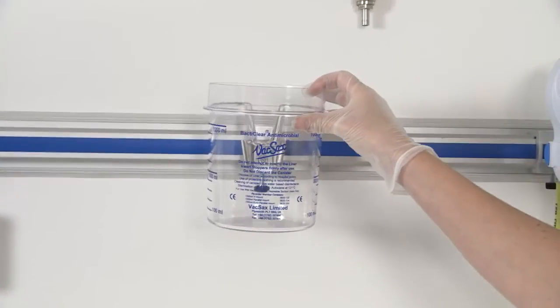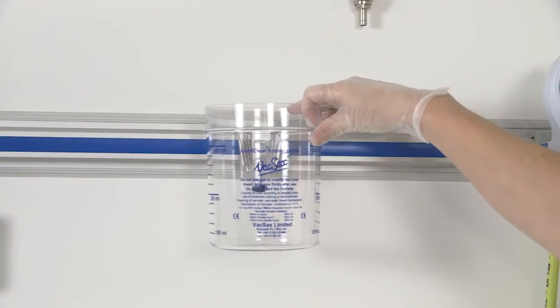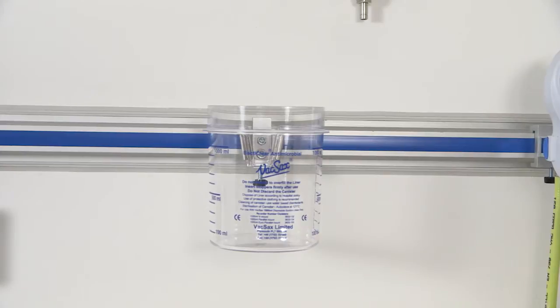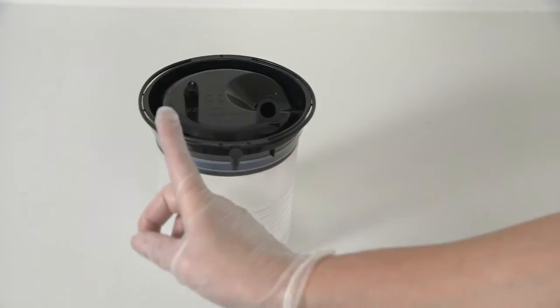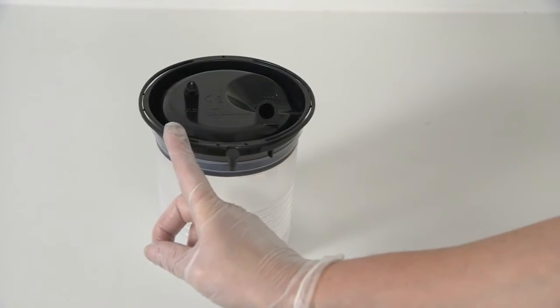Start by placing the 1 litre canister into the wall bracket. Take note of the vacuum port and then the patient port. These are unique and cannot be misconnected.